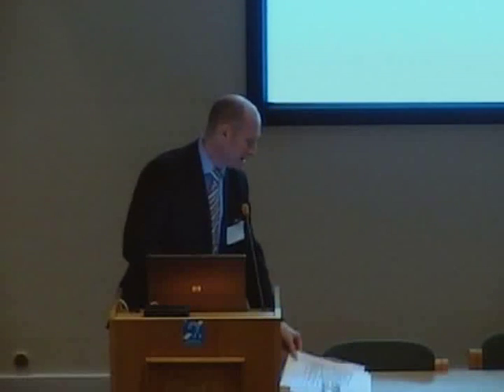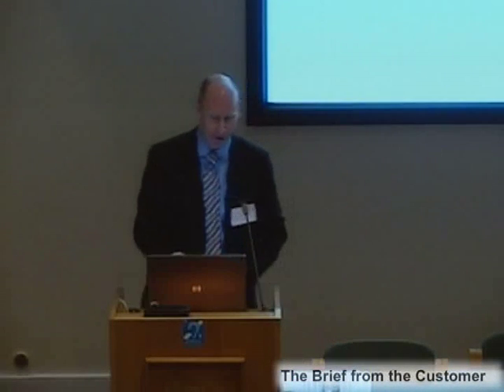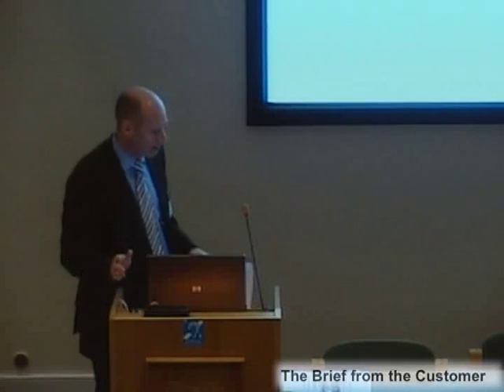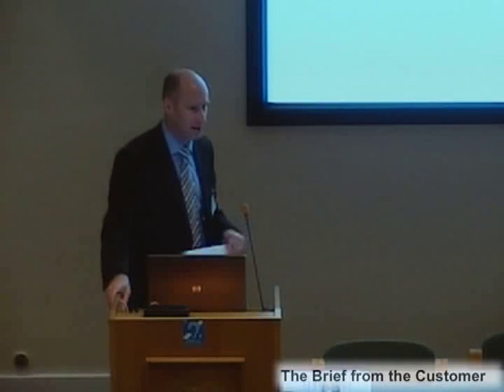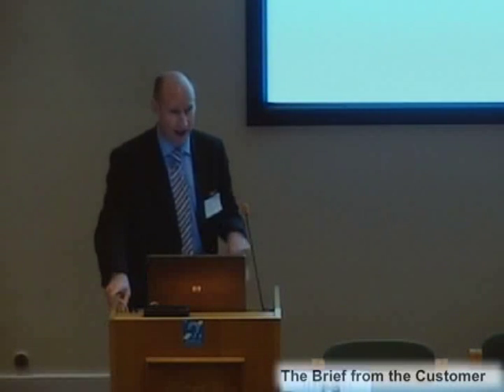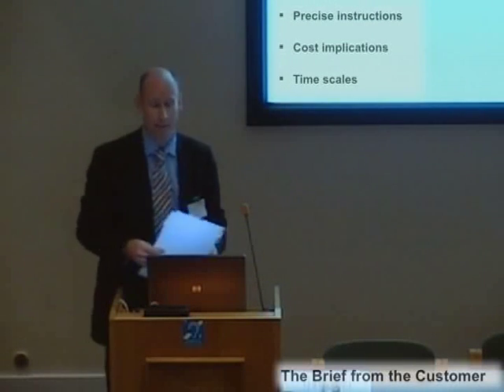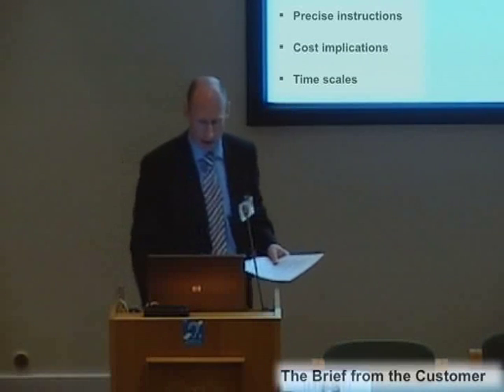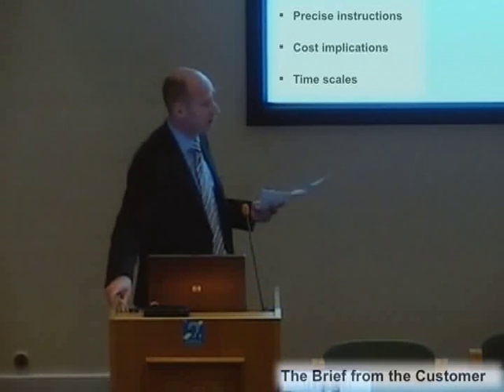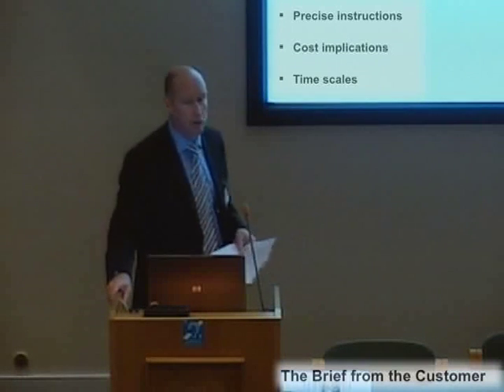I've put this topic in because it's always slightly contentious, because it can be misleading in several different ways. The brief from the customer. Now, it sounds obvious to most people, but the brief from the customer to us as equipment manufacturers is critical. And the clearer and the more precise instructions we can get from you as the customer, the better your layout and design is going to be, and therefore preventing possible modifications further on down the line. If we do have to make modifications, which is quite often the case, there could be cost implications. Depending on the type of modification, how large it is, there could be an awful lot of costs.